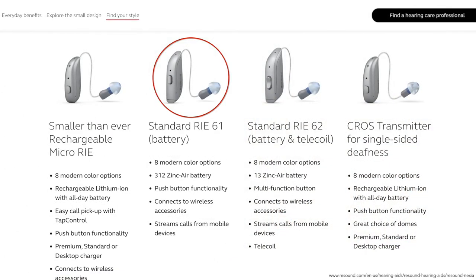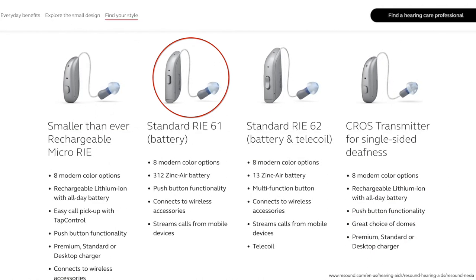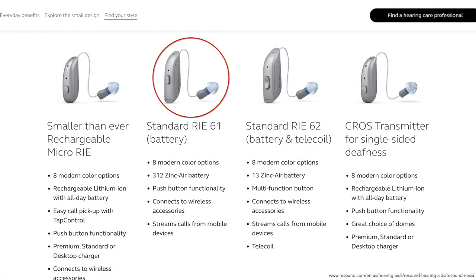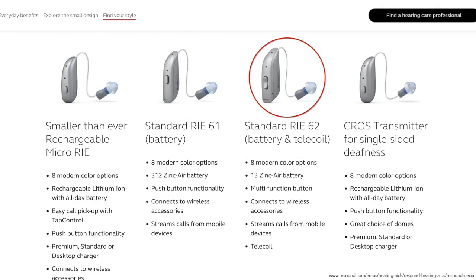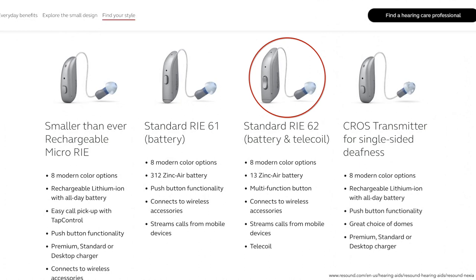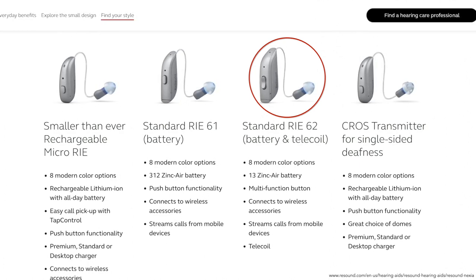The RIE-61 uses a 312 disposable battery, has a push button control, and wireless connectivity. The RIE-62 uses a 13 disposable battery, has a multi-function button, wireless connectivity, and a telecoil for better hearing on a landline phone.